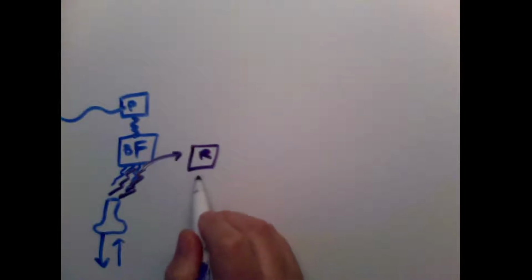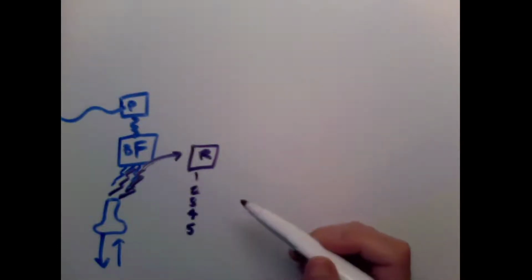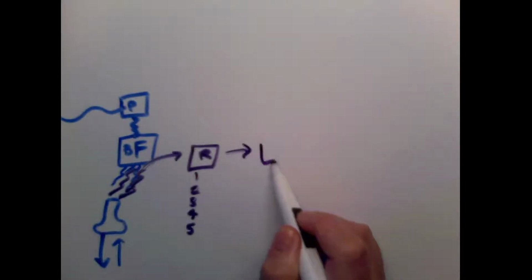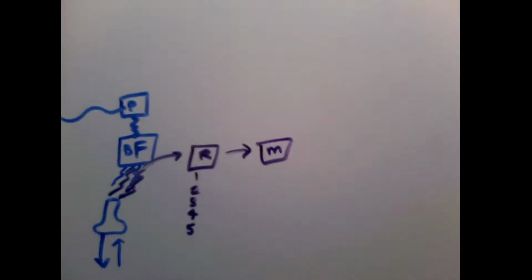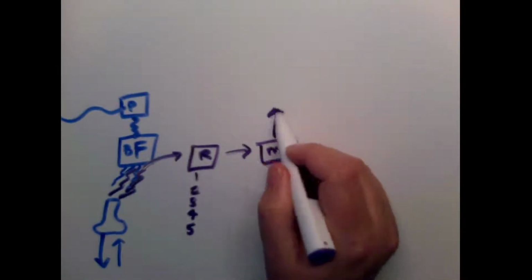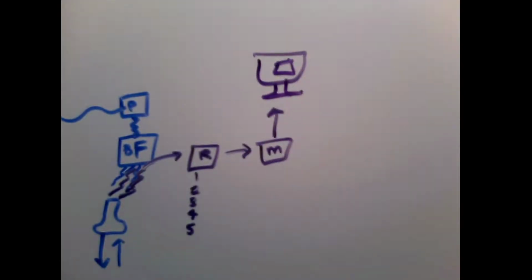And the receiver has 5 functions that it is going to go through. After those 5 functions occur, it is then going to head off to memory, and this is what we'll talk about in the next unit. So the memory takes it and figures out how to put it on to our display. So we get our picture. The display then is available for us to visualize, but then we also need to typically store the ultrasound information that we get.